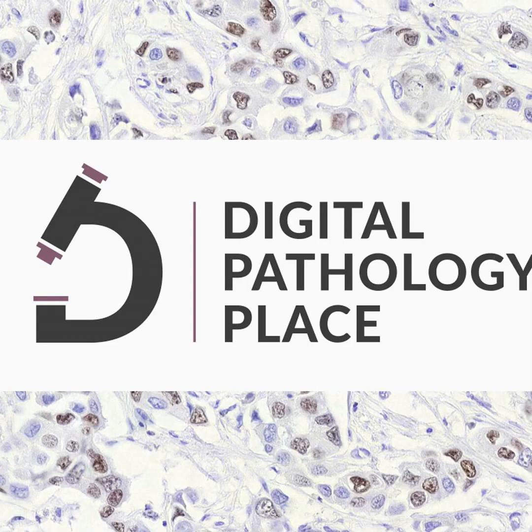Yeah, I was talking about dimensionality in the spatial component, and there are millions of cells, and that's where really image analysis is key. So if you want to do spatial phenomics or spatial biology exploration, you need to get all the cells and all the phenotypes in their location. In theory, for an H&E, you could have a classification approach where you say responder versus non-responder. But if you want to go into this really high-dimensional spatial biology, you have to get all these cells. And that's where you need certainly computer-based image analysis. And that's also one of the challenges.